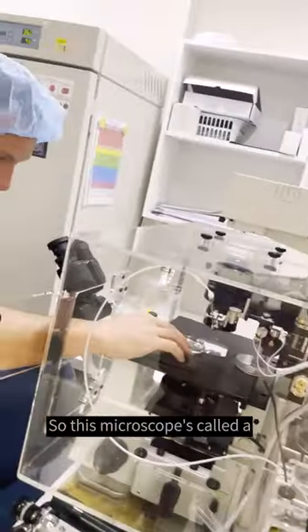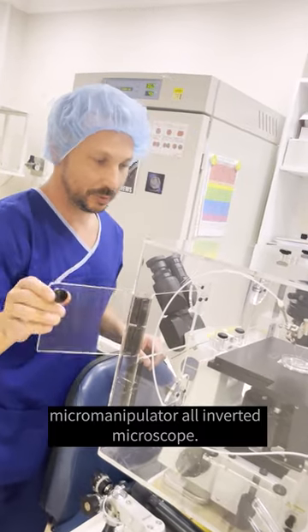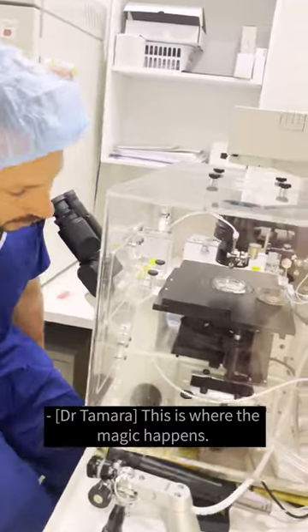This microscope is called a micromanipulator — it's an inverted microscope. This is where the magic happens.